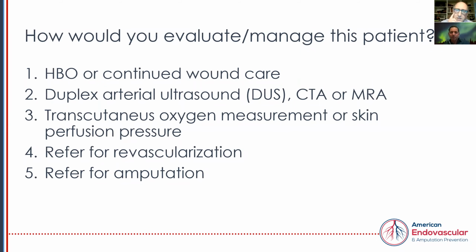So my approach to these cases: patients can present with several different findings when they have chronic limb ischemia. They can present with ulcerations or frank gangrene. These are patients who obviously have significant multifocal disease on presentation. Once they're presenting with an ulceration, we know they're going to have something there, most likely in the distal vessels. So my approach has always been to get as much information as possible. Obviously, we've got the history and physical examination, but the first thing that we'll do in our practice is perform ankle brachial indices and then a duplex ultrasound.